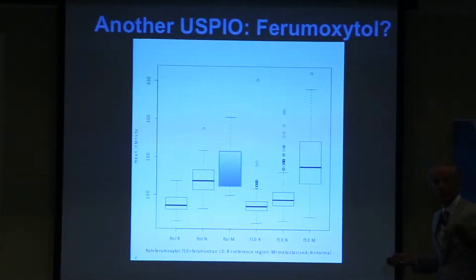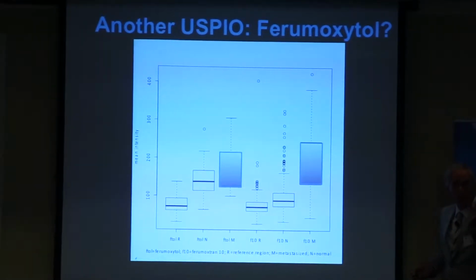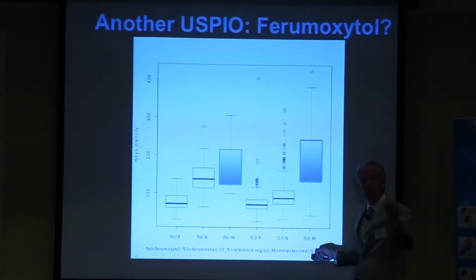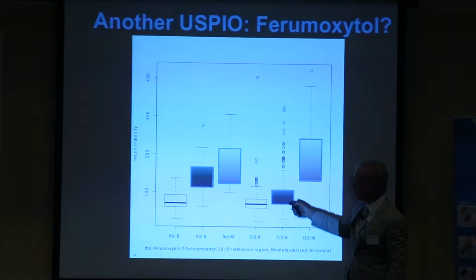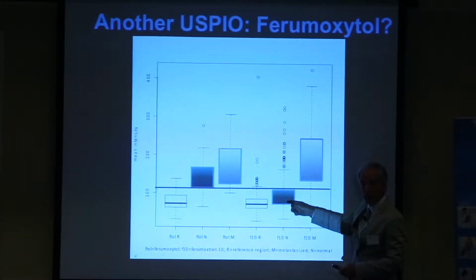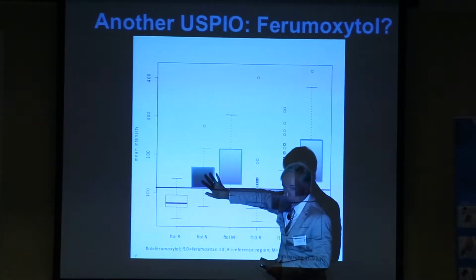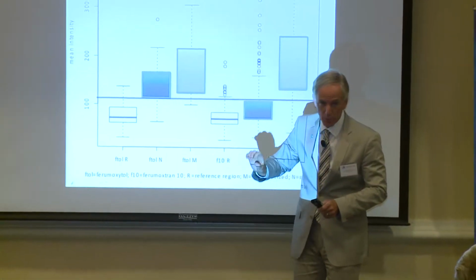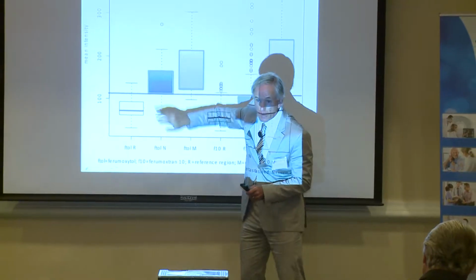This is reference tissue. Now look at the positive lymph nodes. They contain cancer, no iron. That's bright, and it's bright. It's about equal. But now let's look at the negative lymph nodes without cancer. They should be dark due to the macrophages. Ferumoxytol, Combidex. And with Combidex you can draw a line between normal, black, and abnormal, white. And here's overlap. That means that it's not bad, but it has a limited specificity. You may have false positive lymph nodes, and you may radiate too many lymph nodes.